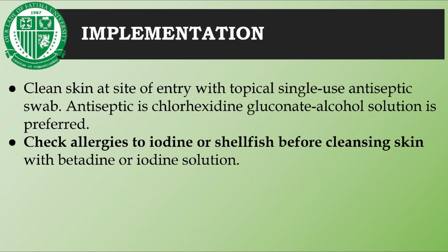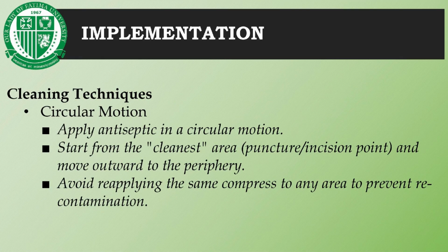Clean skin at the site of entry with a topical single-use antiseptic swab. The antiseptic is chlorhexidine gluconate alcohol solution, which is the commonly preferred antiseptic. Check if the patient is allergic to iodine or shellfish before cleansing the skin with betadine or iodine solution. Before we proceed, here are some of the cleaning techniques we can use to clean the insertion site.